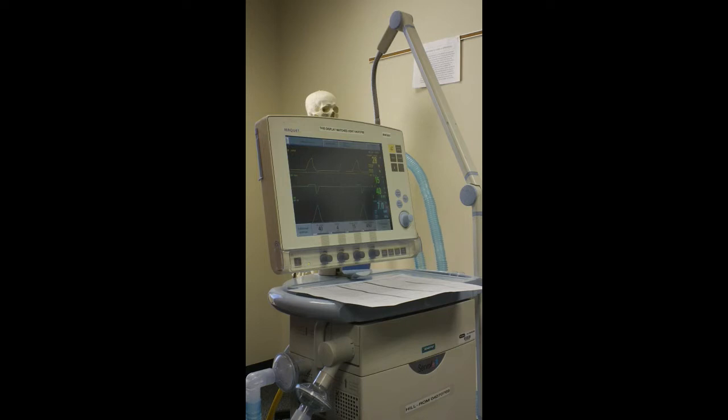Okay, PIP, peak inspiratory pressure. You will also see that listed on some vents as P peak or just peak, like peak pressure.